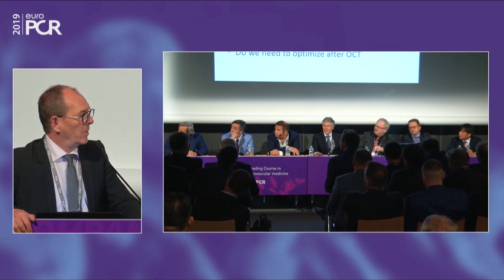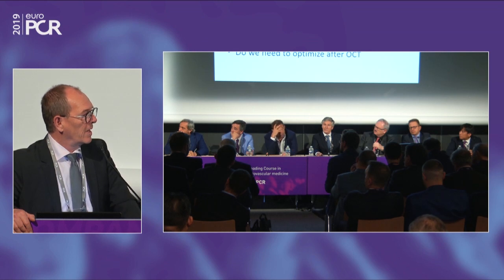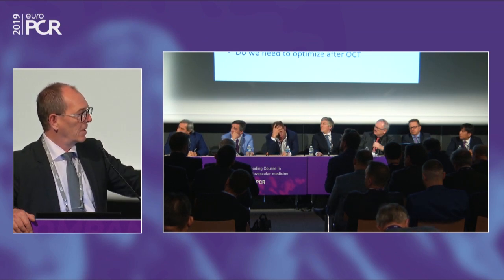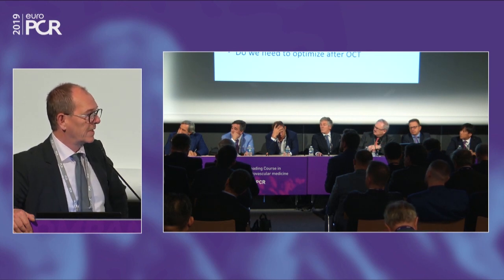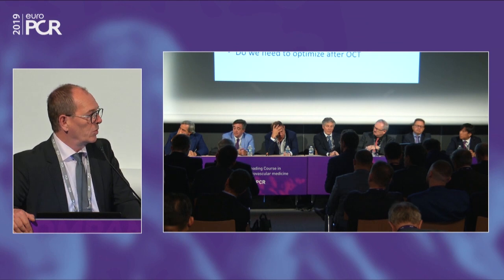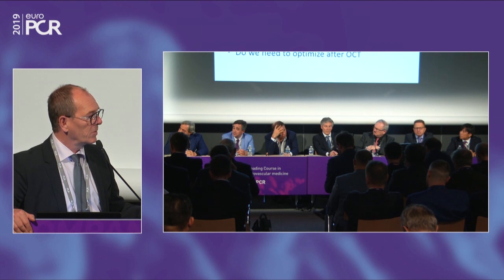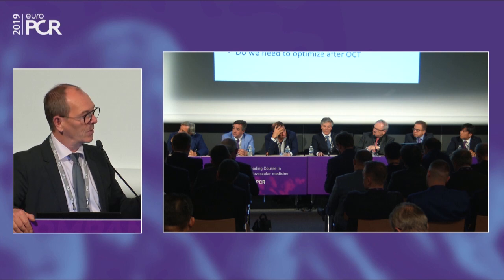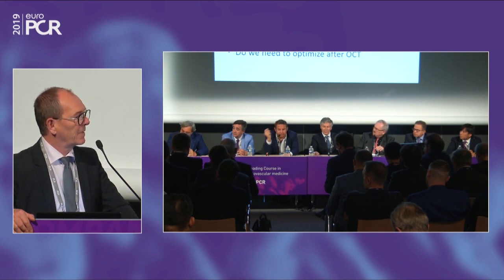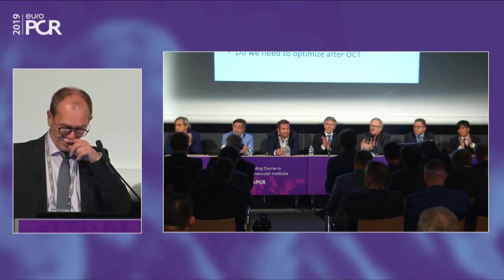That's clear for me. Rotablation is just to avoid stalactites and stalagmites, to be sure to cross with the tools. But for the final expansion, shockwave is an option, but good preparation with a non-compliant balloon, that's clear. We don't have the perfect tool to make it. Maybe atherectomy will be a good candidate, but to do such complex cases fast, safe, and easy in routine, we don't have the full answer. But this tool is very interesting to help us make something simple. Thank you very much, Luc. It was very good.